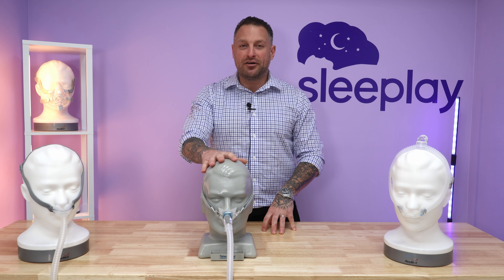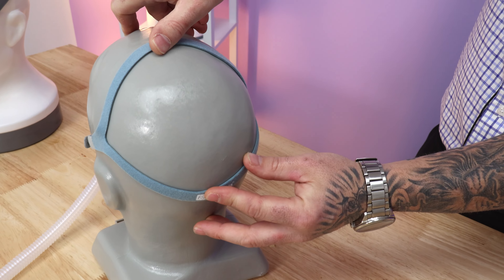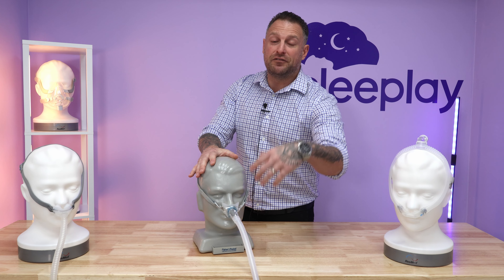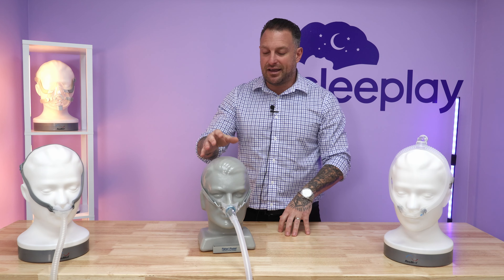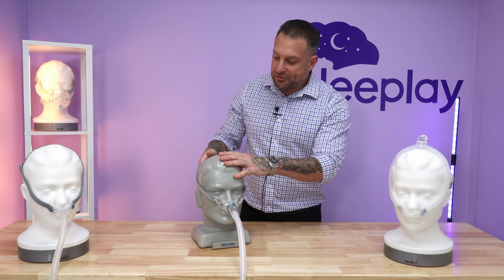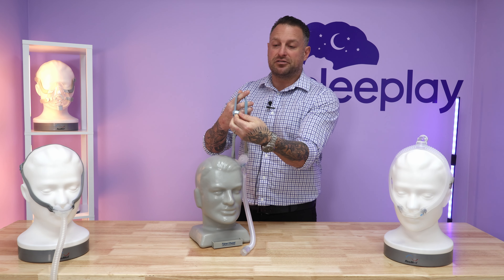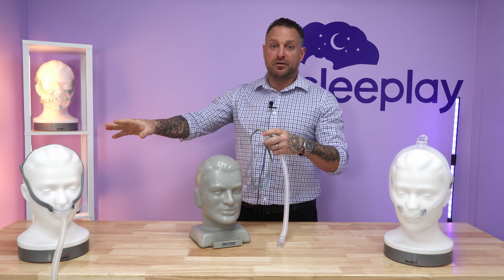Next up, we have the Fisher & Paykel Brevida nasal pillow mask. It's a great mask as well. It has a little more sturdy headgear — it's not stretchable, but it's sizable. Similar to the AirFit P10, it does have the extra foot of tubing. If you do like an extended tube, a lot of people do, so you can have the machine far off and if you toss and turn, you don't have to worry about it pulling off the nightstand. It also has two straps — one goes on top of the head and the other strap goes in the back, same as the AirFit P10.